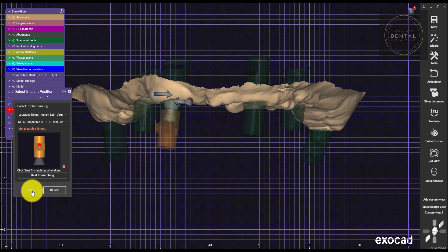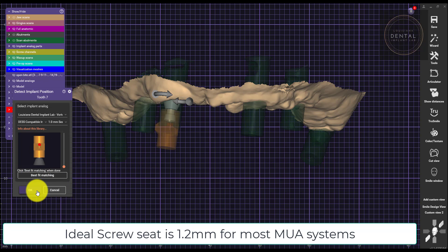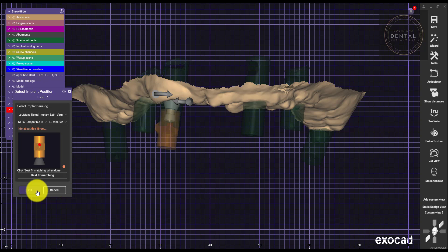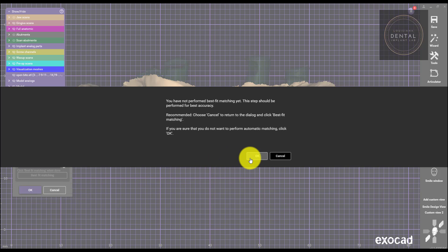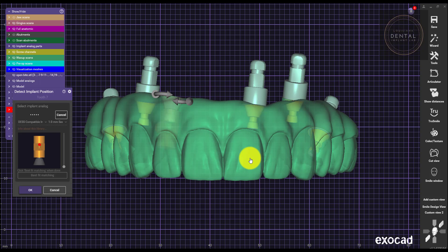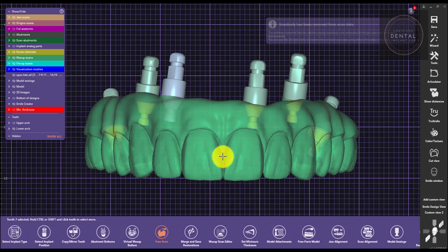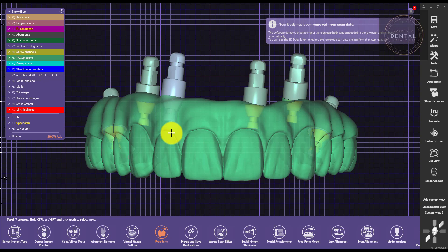And for this case, I'm just going to show you a one millimeter screw seat. What we recommend is a 1.2 millimeter screw seat for most implant systems. Just make sure you know what implant system you have and how deep the screw seat is.